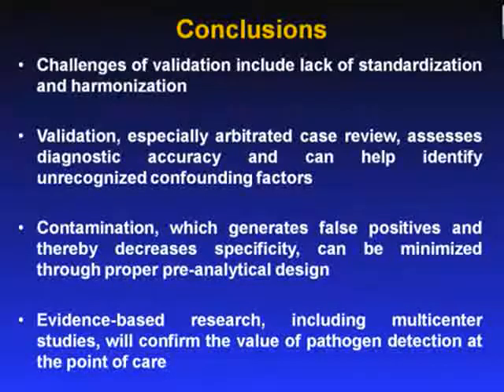In conclusion, challenges are associated with validation procedures. The analytical challenges include lack of standardization and harmonization for comparing and reporting results, as well as calibration procedures. Some clinical challenges involve the lack of a suitable universal comparison method, as well as the difficulty with calculating predictive values when limited to a discrete test panel.